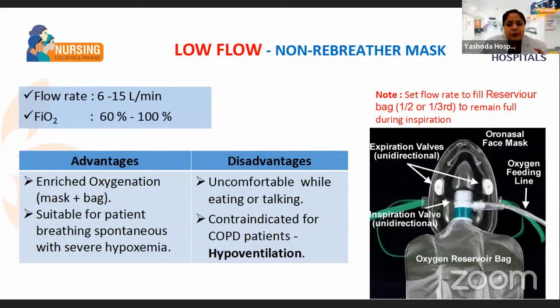When the patient starts inspiration, the valve will open, then the patient is taking pure oxygen. When the patient is exhaling, the ports will open and the carbon dioxide will escape from the port.